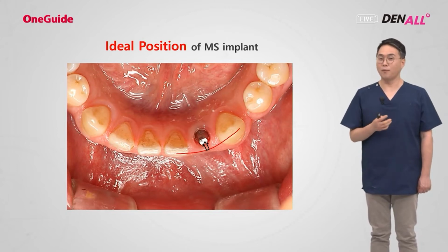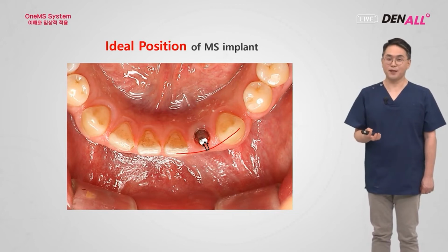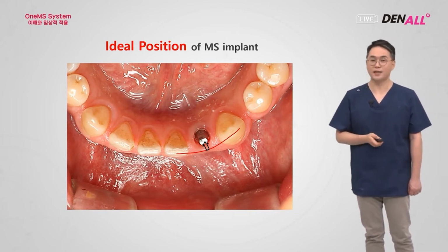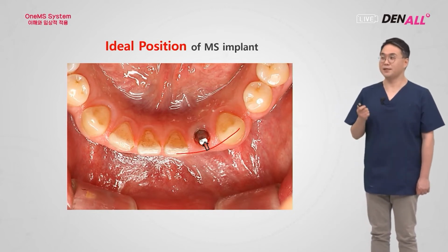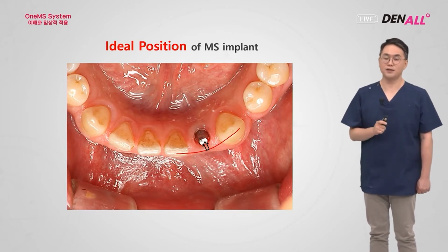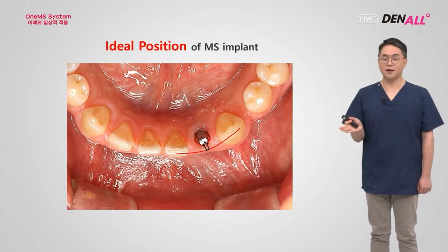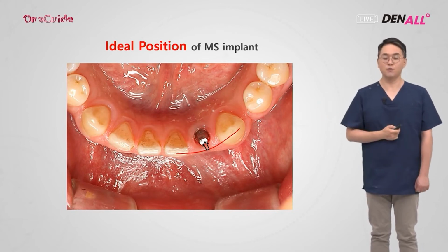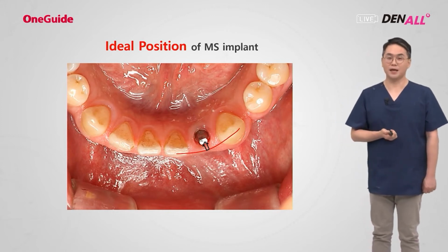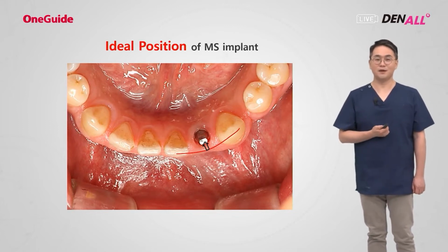It's a one body implant, so for the abutment, bending depth area, or as in a two-piece type abutment, angle compensation or correction is not possible. So in this implant, the mesial-distal, buccolingual position and angulation all need to be correct. So the labial surface should line up with the adjacent teeth, and you have to go a bit toward the lingual side. So it's very dependent on your experience. If you're not experienced in implant placement, it might not be the first implant system you would go for.